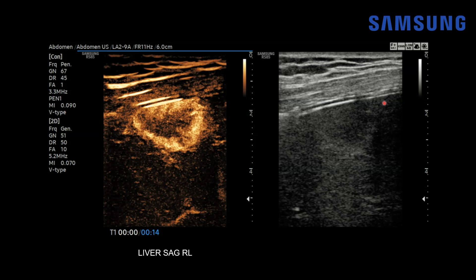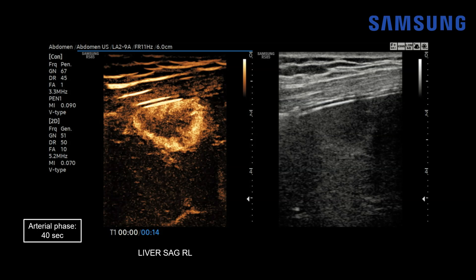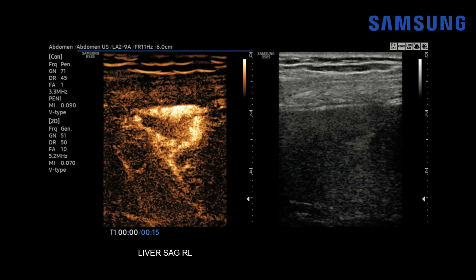On the right-hand side we're looking at the grayscale B-mode image, and on the left-hand side is the contrast-enhanced ultrasound image with the background suppressed. We're about 14 seconds post-contrast injection and saline flush — in the arterial phase, which continues until about 40 seconds. You can see this lesion has peripheral nodular globular enhancement. We slightly sweep through the lesion to show other areas of enhancement.